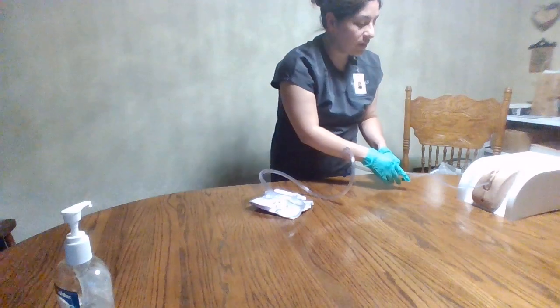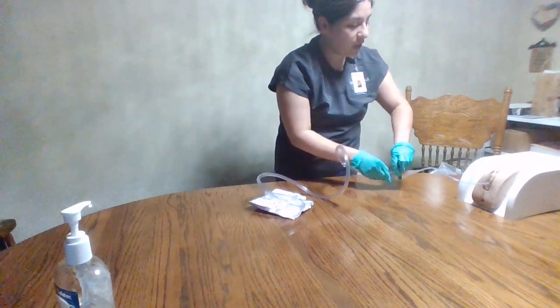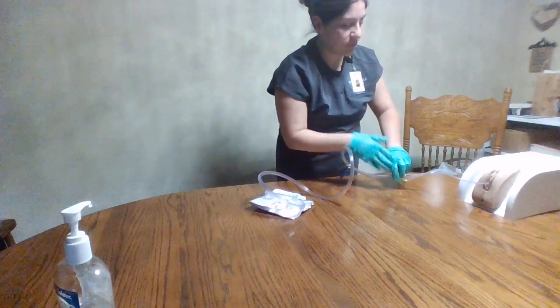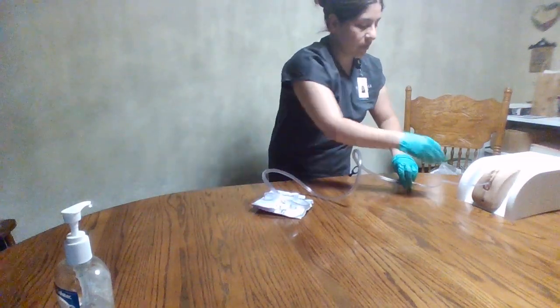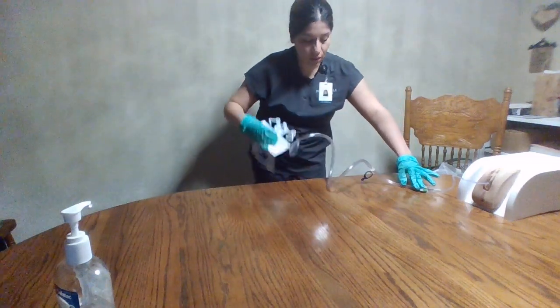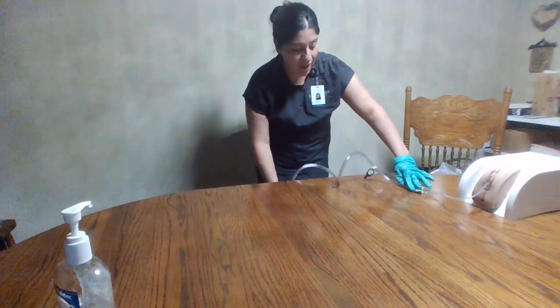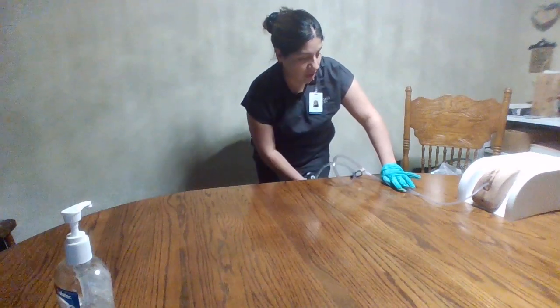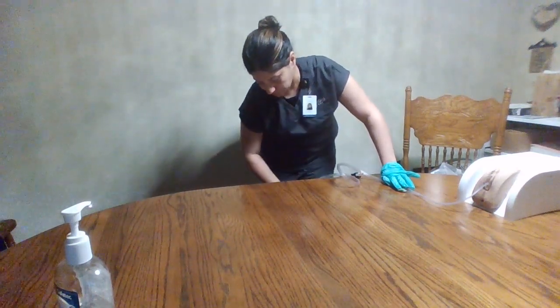Right, Mrs. Smith, I'm going to attach this tubing to your inner thigh, making sure to leave enough slack so that there is no tugging. And then with your catheter bag, I am going to place it right down here at the base of the bed on the frame, okay?